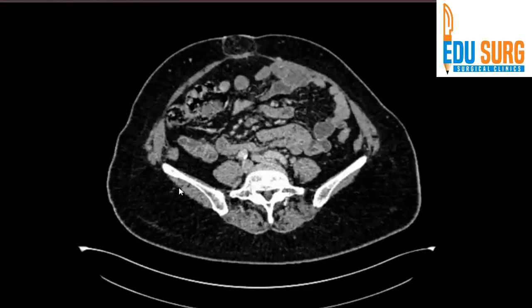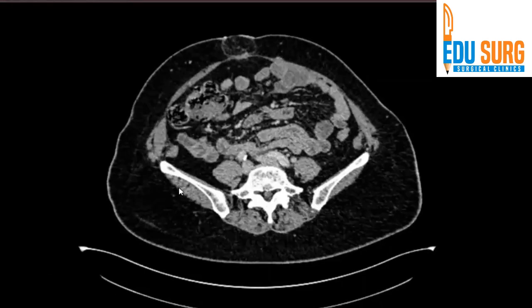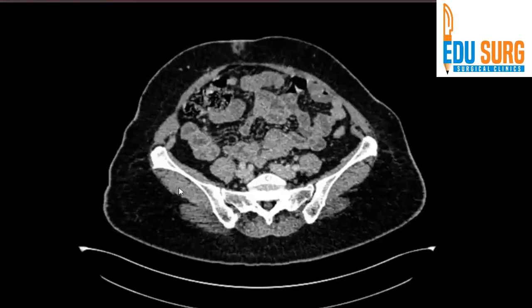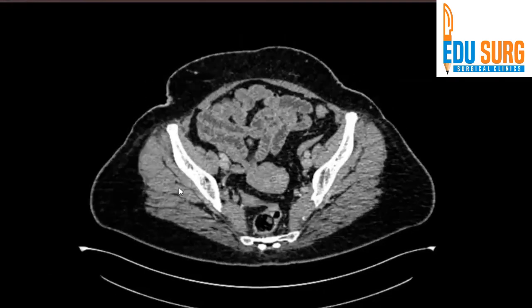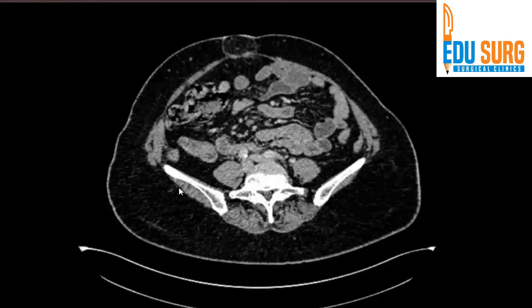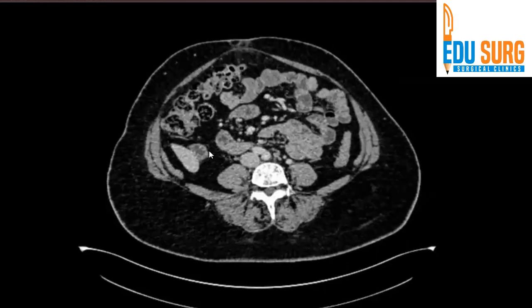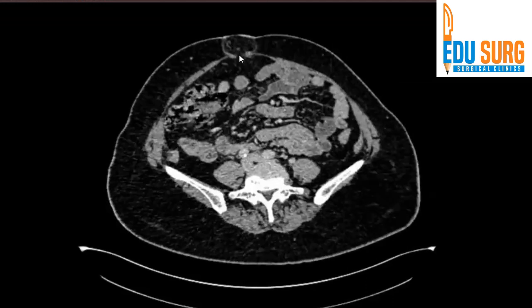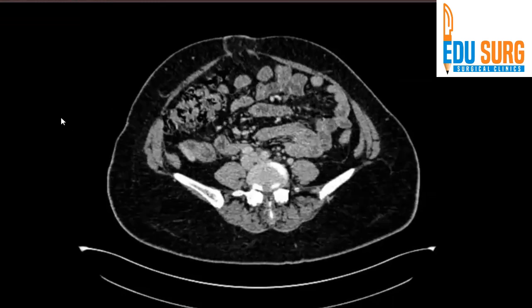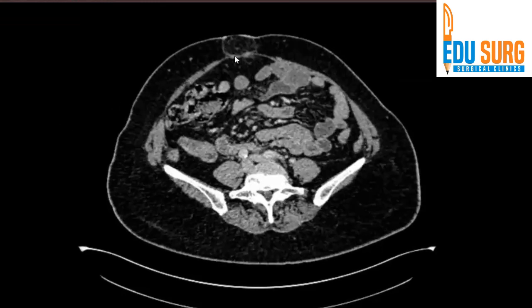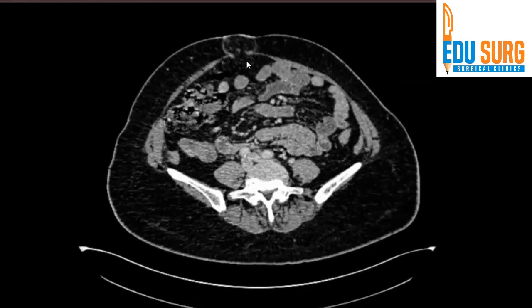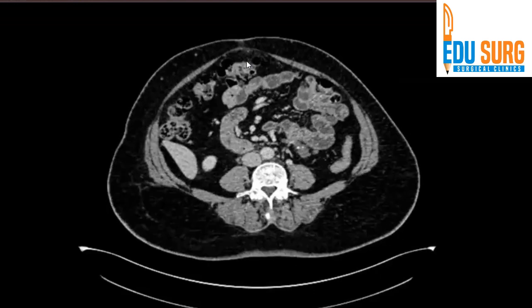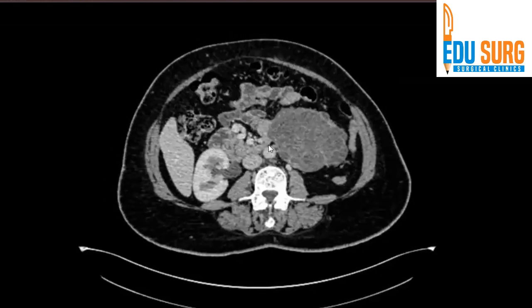Now let's dive into this scan. There is no metastatic disease — you have seen the entire scan. There is an incidental umbilical hernia, so let's get that point out of the way first.